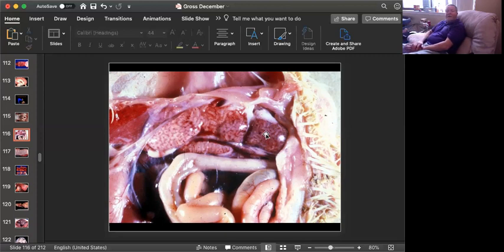There are 2 possibilities here. One is that we have diffuse tubular necrosis. So this would be a diffuse renal tubular necrosis. And when you think about that, you want to think about one particular virus. It is a coronavirus, and it causes infectious bronchitis. And you're like, infectious bronchitis in the kidneys. Well, there is one nephrotropic strain, which is going to cause diffuse necrosis of the proximal convoluted tubules.